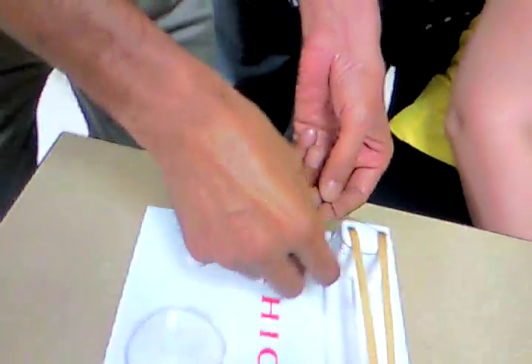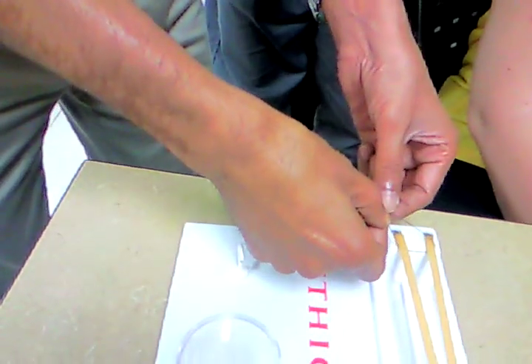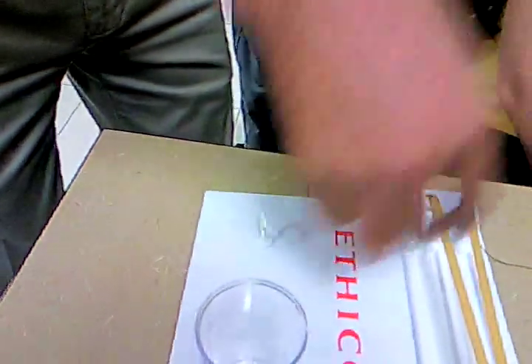axis. If you had reversed it, it would have become a granny knot. That is not a good knot. This is a square knot, this is a surgical knot. This will never slip, so you can do it. Can you try that again?